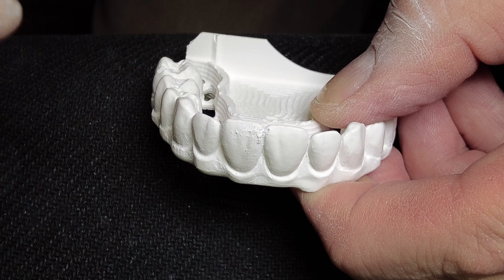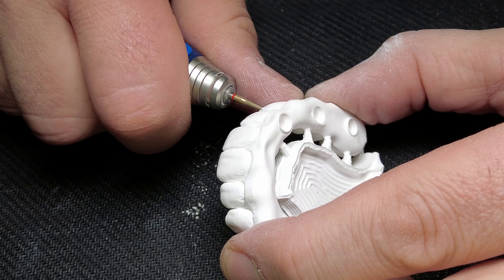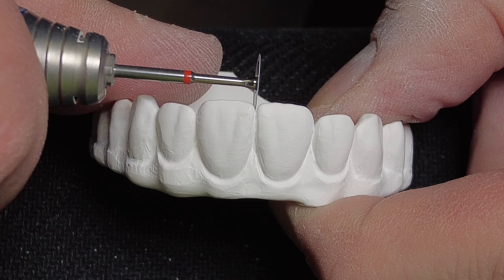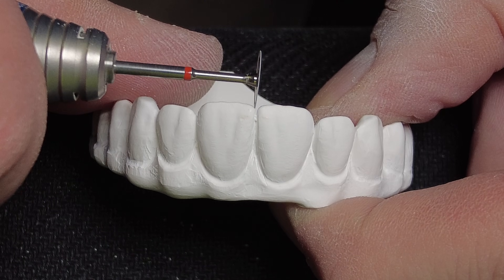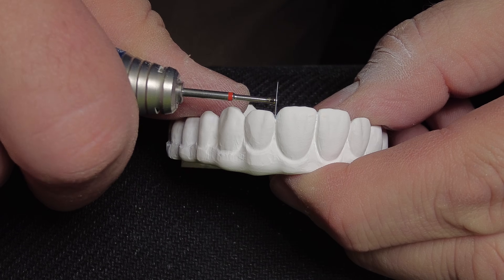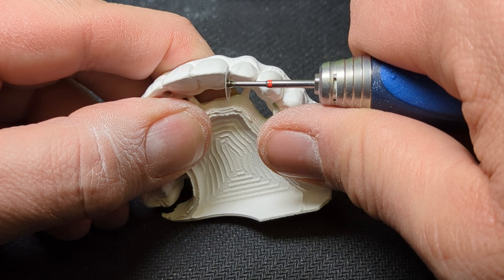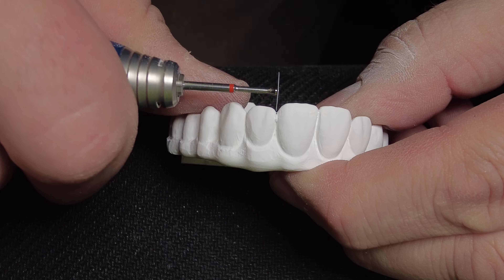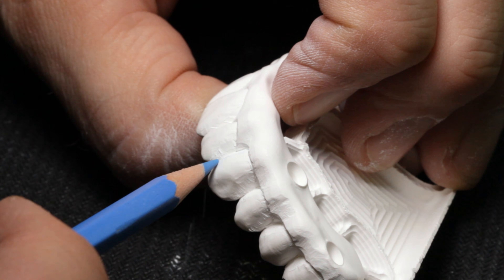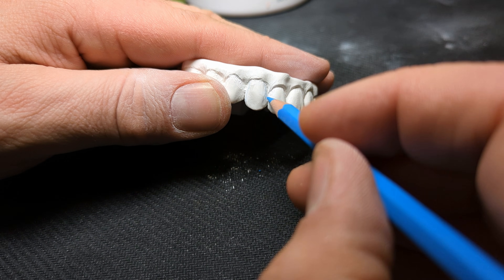With a fine diamond, I can refine the areas the disc does not reach. I have been visiting many labs and I don't understand why technicians don't spend the extra time in green stage contouring, but like to grind so much on the sintered zirconia. Incisal embrasures are especially easy to open in green stage and you don't risk creating micro-fractures.